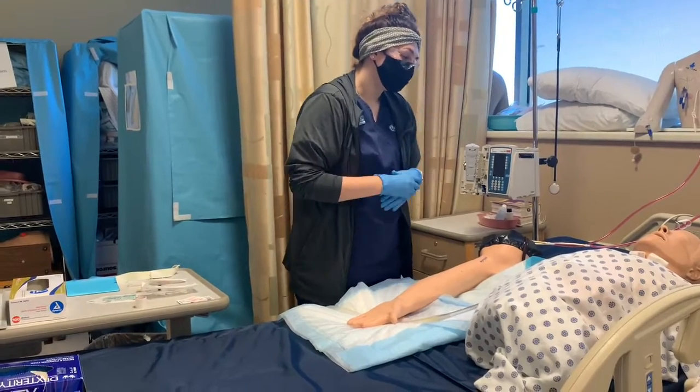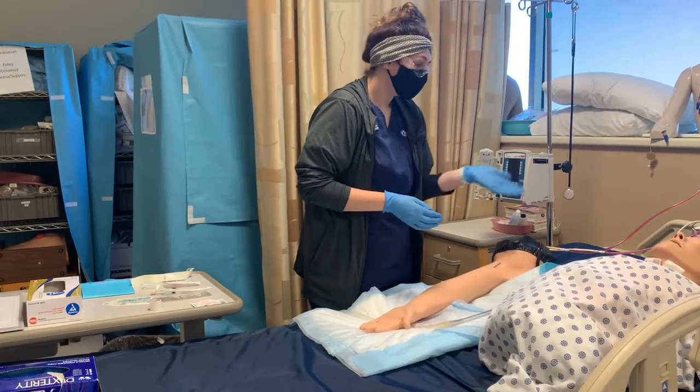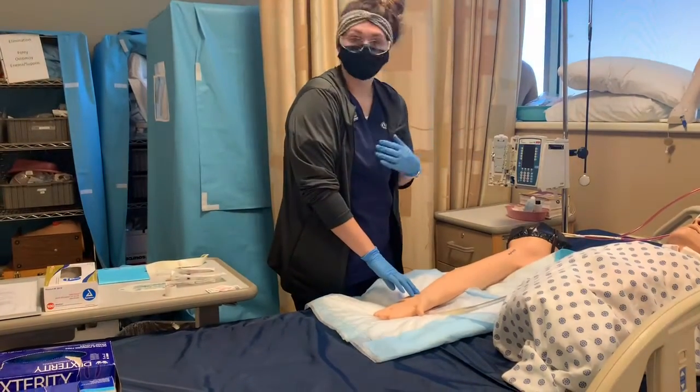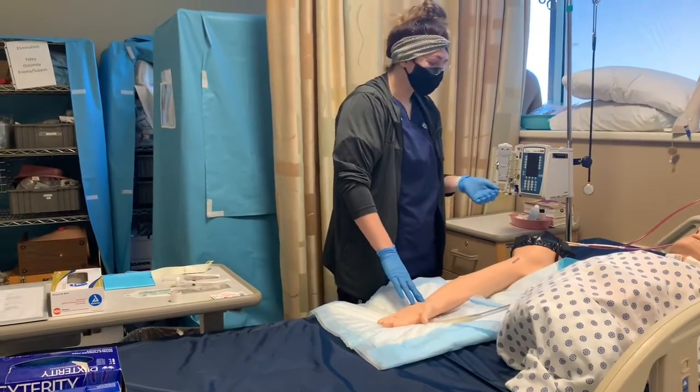Jones. My name is Shayla and I'm going to be your nursing student. Can you tell me your name and your date of birth? Okay, she does, and it matches her wristband, so I know I have the right patient.